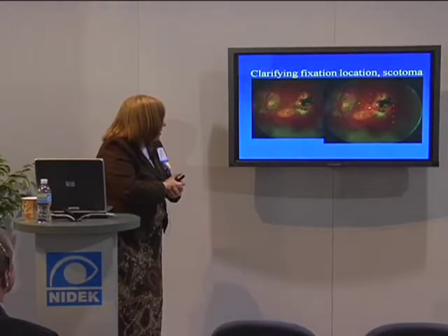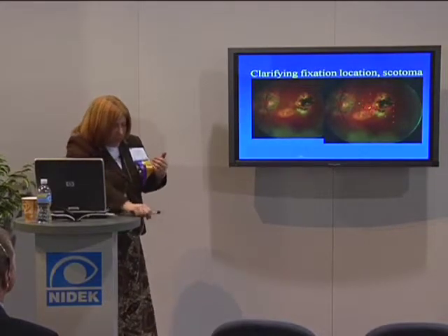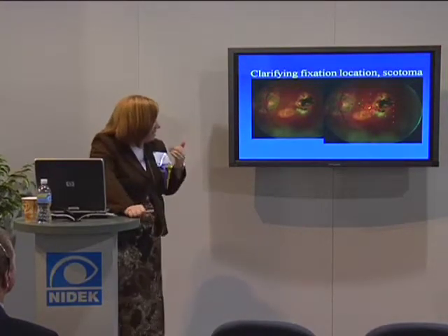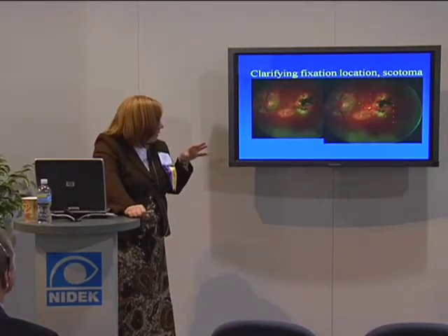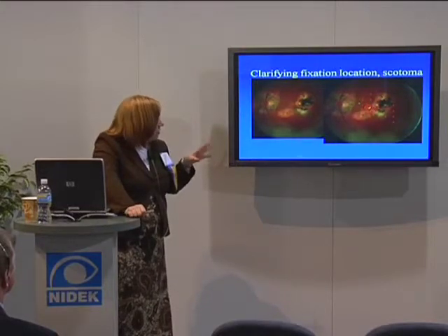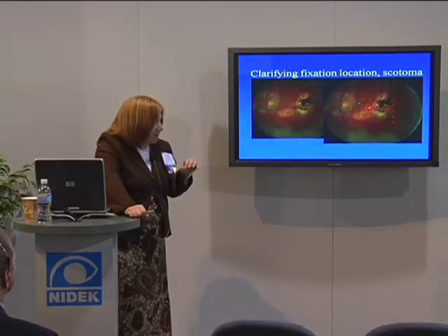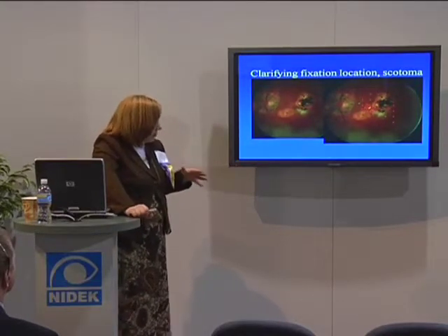I was mentioning earlier, it's very interesting. I think that the MP1 in a sense has a bigger role in terms of macular degeneration since in wet macular degeneration, now that Lucentis and Avastin anti-VEGF agents are used.